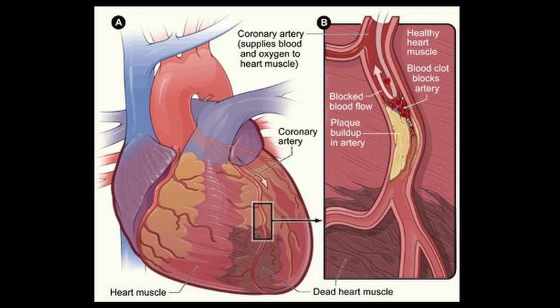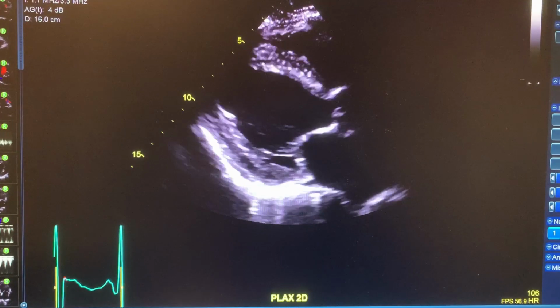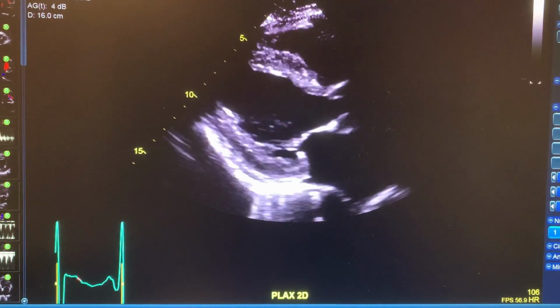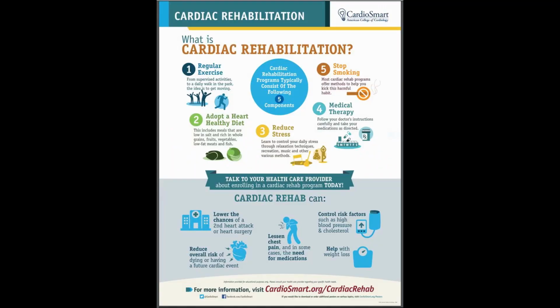It can assess people's symptoms such as chest pain that might represent a blockage. It can also assess things like shortness of breath. It can help us with fainting spells, particularly if they occur with exertion. We often use these sorts of tests to evaluate for heart rhythm disorders, as well as people that just have known heart disease, and we want to see what happens when we exercise them and whether it's safe to do that. We often do this before heart rehabilitation programs.